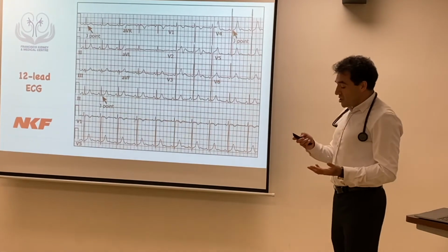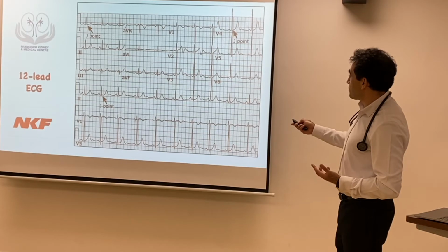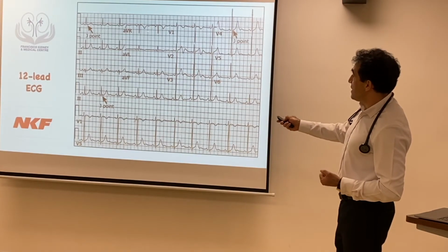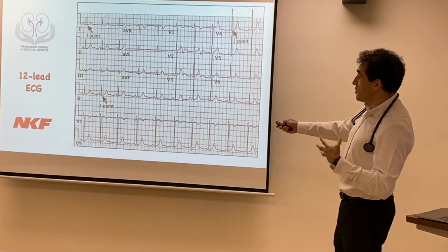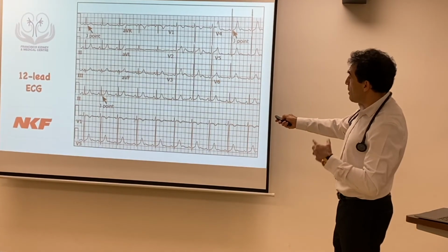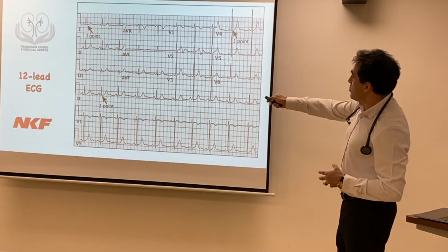And all of these generate what you know as a 12-lead ECG. Every one of those electrodes and leads I mentioned is recording this. So there are 12. Remember, I gave you 6 precordial, 3 bipolar and 3 unipolar limb leads. So that's why it's 12 leads, and you can count them yourself.